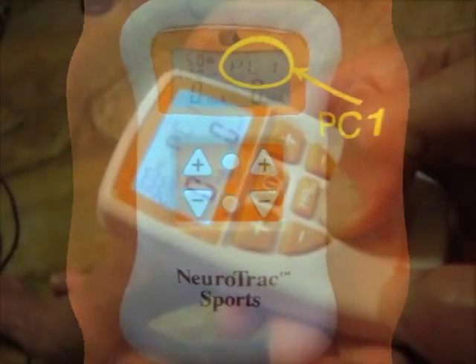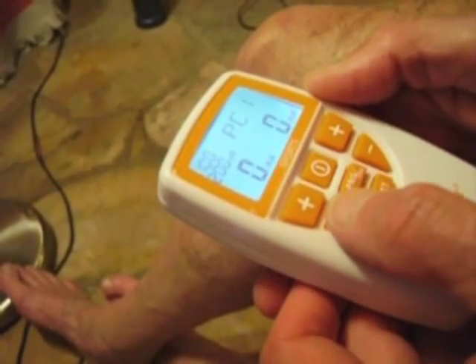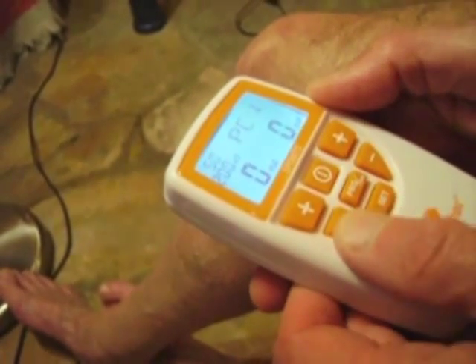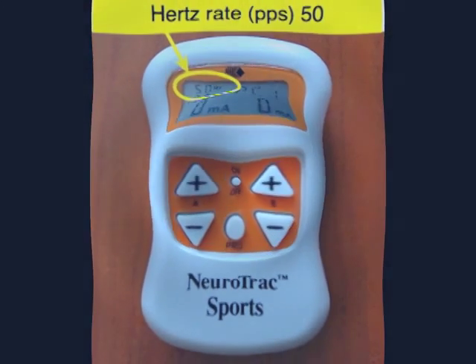Press set firmly until you see the two little letters HZ in the top left-hand corner flashing. This is the hertz rate — the pulses per second at which the current operates. For rehabilitation work with muscles like the vastus medialis obliquus, it should be set to 40 or 50 hertz. I generally use 50 hertz.